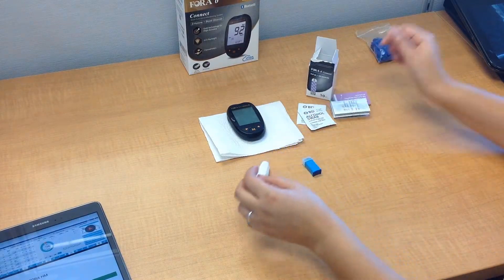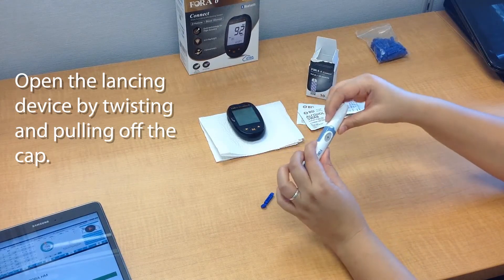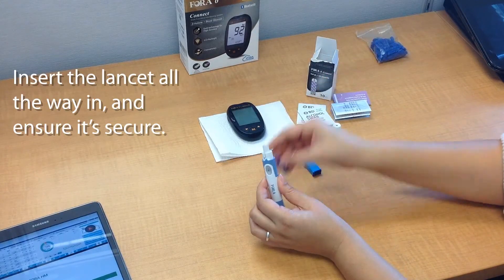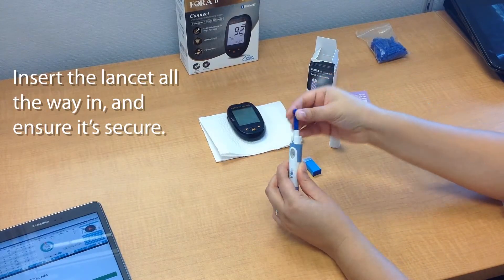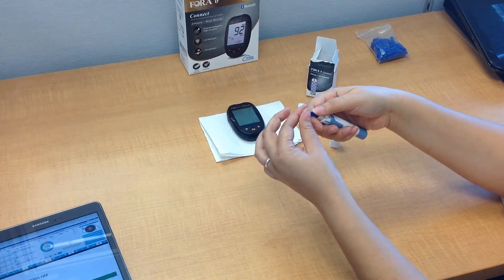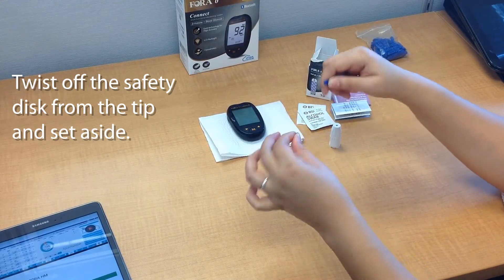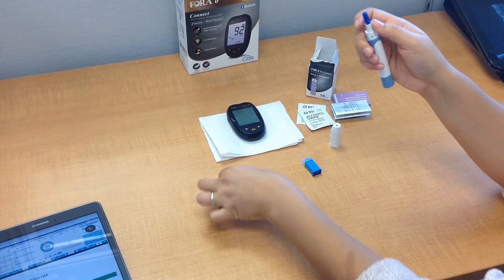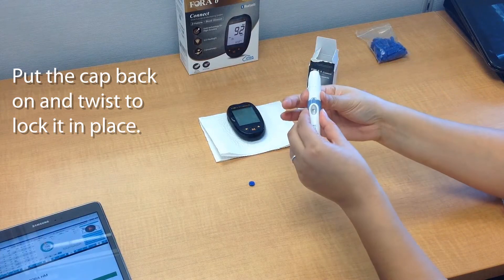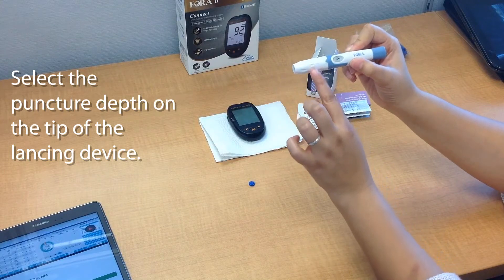Now let's set up our lancing device. It looks like a pen. Turn the tip off, pull it off, and then go ahead and insert the lancet — make sure you push all the way through so that it stays. Then remove the safety disc to expose the needle. Put the cap back on the pen and lock it.